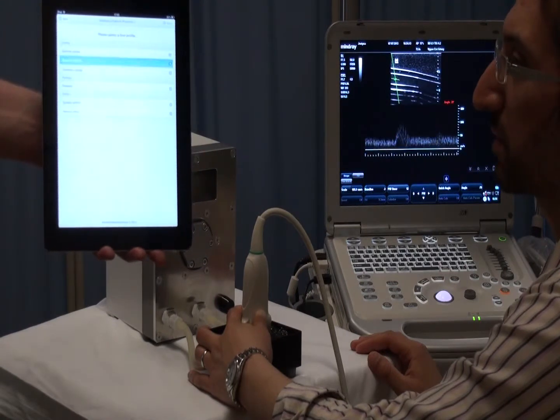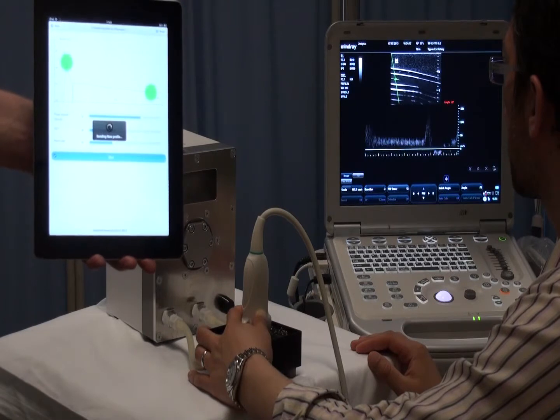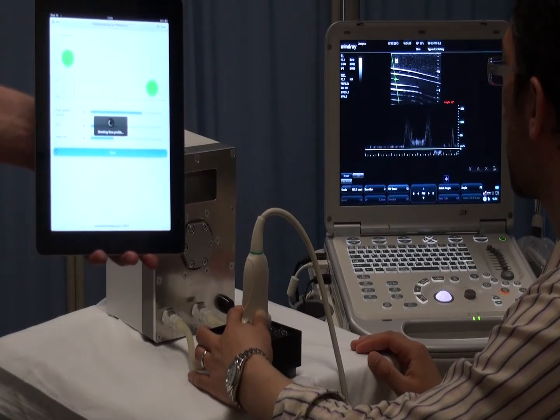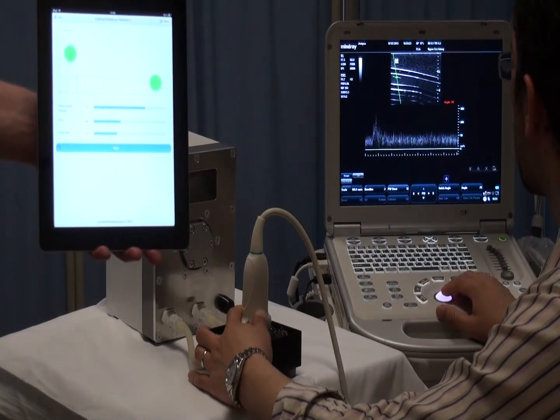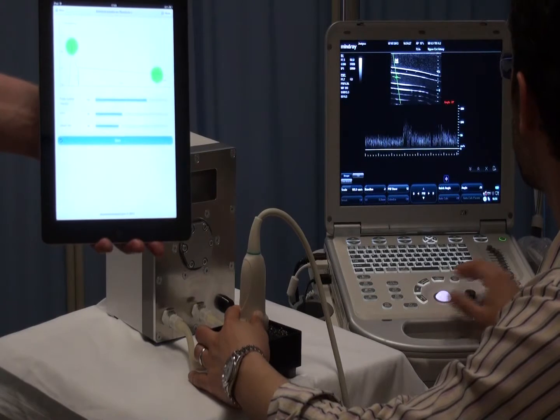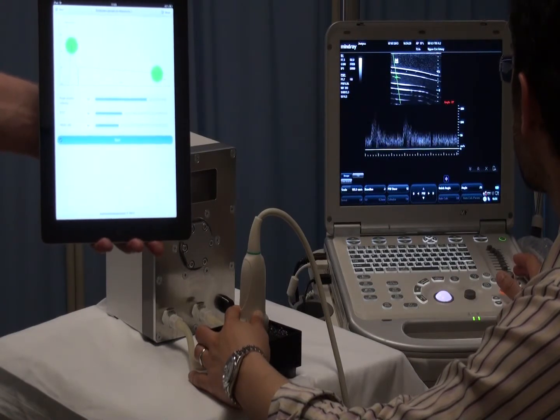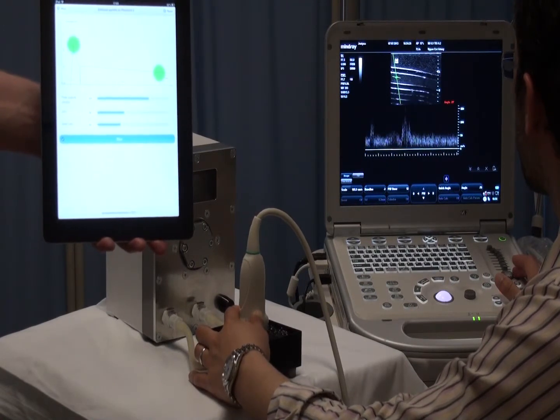External. Send that profile. Machine's resetting itself. Yeah, and here is an external carotid waveform, more peaky, with a little notch here, a dicrotic notch type picture.